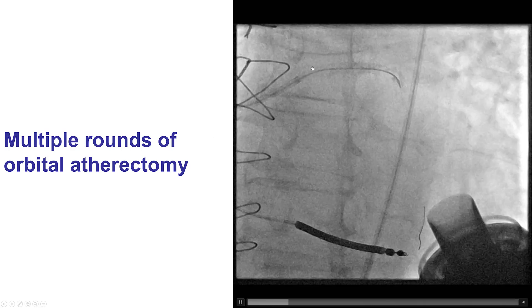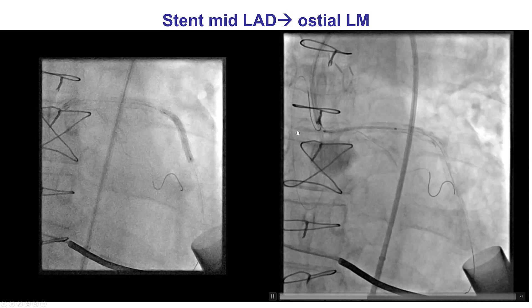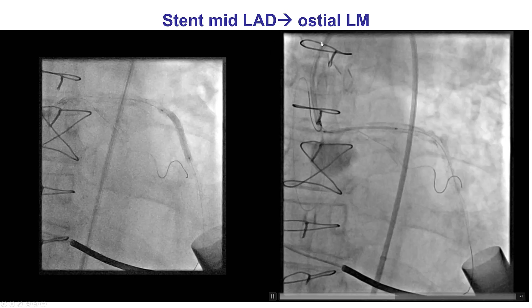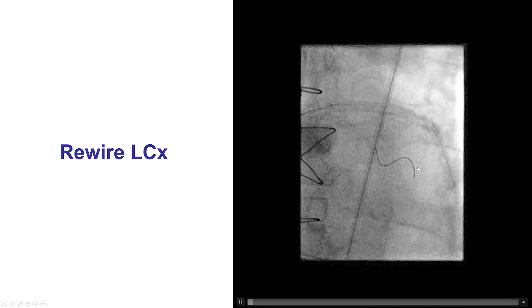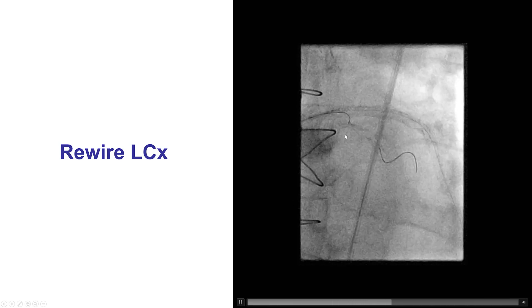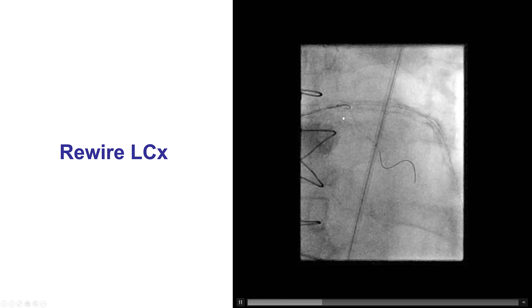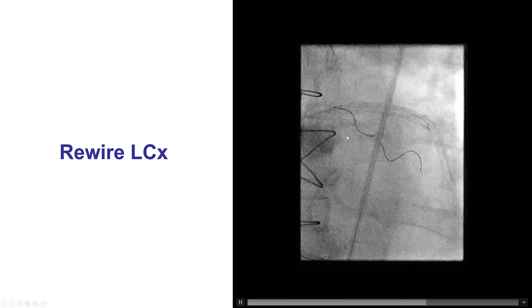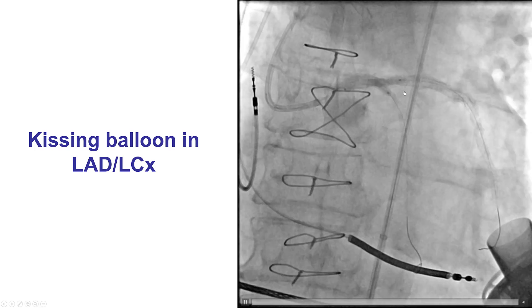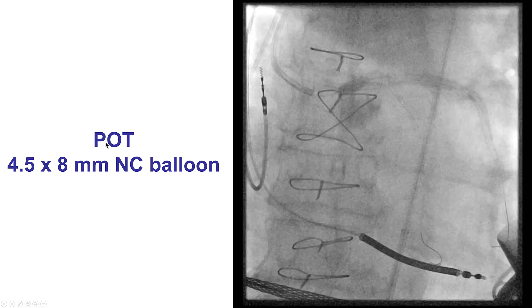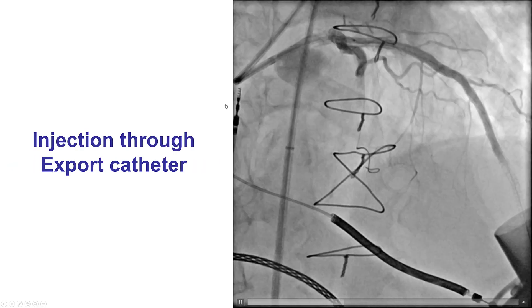Removing the circumflex wire during atherectomy is important to avoid potential fracture of the wire when the atherectomy crown reaches it. We then placed stents in the middle LAD all the way to the ostium of the left main, jailing the circumflex after inserting a guide wire into it. We rewired the circumflex using a Sasuke dual-lumen microcatheter, which is very useful for facilitating side branch re-access after jailing. We then performed kissing balloon inflation in the LAD and circumflex, followed by final proximal optimization with a 4.5 by 8 mm NC balloon, providing a nice result.